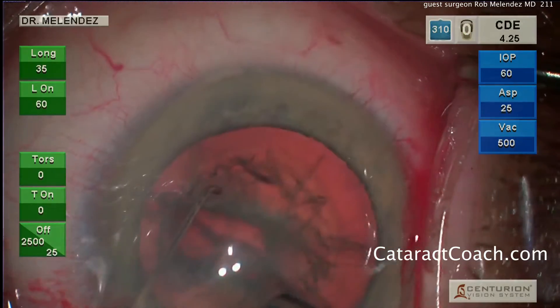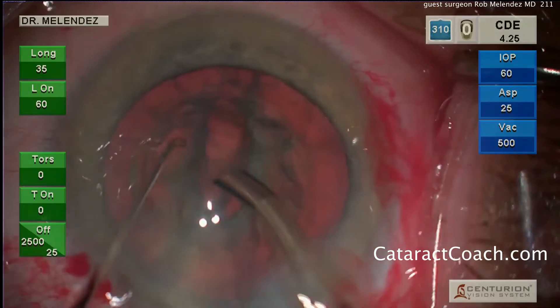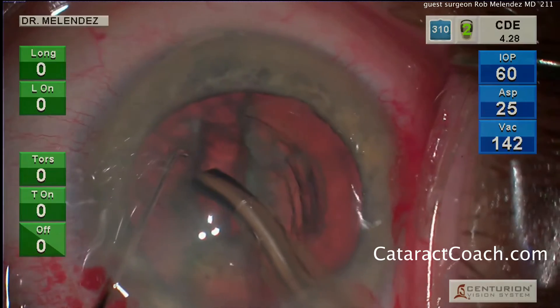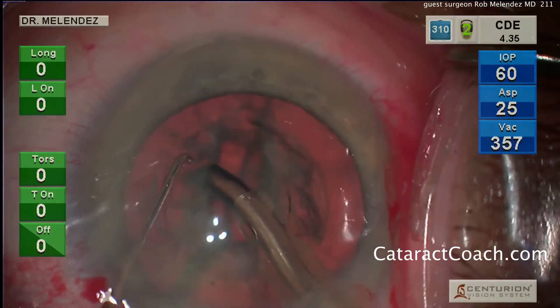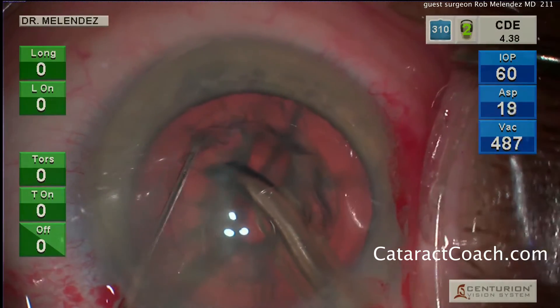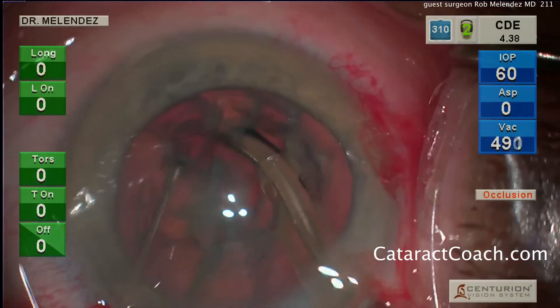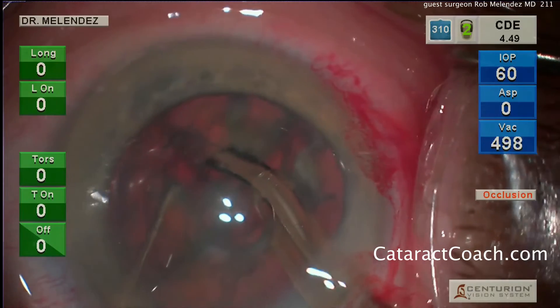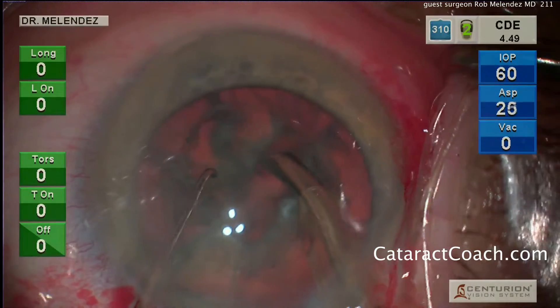Once that's done, you can see the settings have been changed: vacuum is 500, flow is 25, IOP is 60 — much higher vacuum. That allows the probe to engage the piece, buzz into it, hold it, and bring it forward for chopping. Here's a little chop maneuver, and you can see each half is then broken up into smaller pieces.